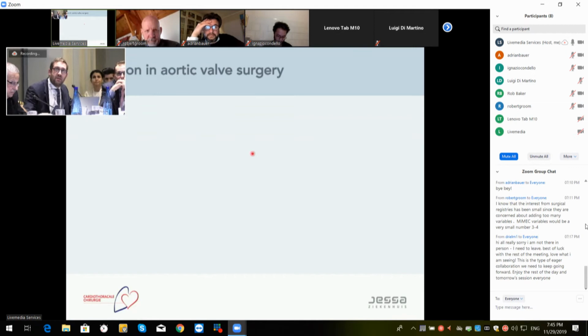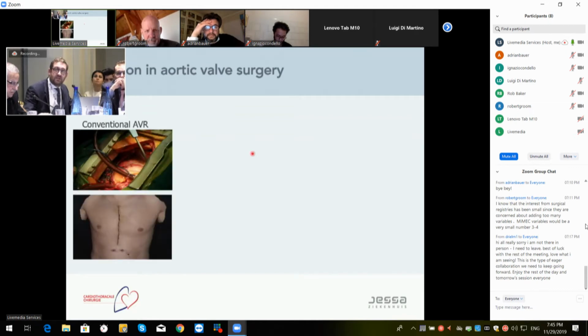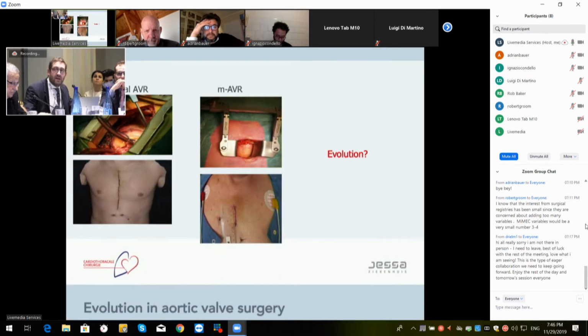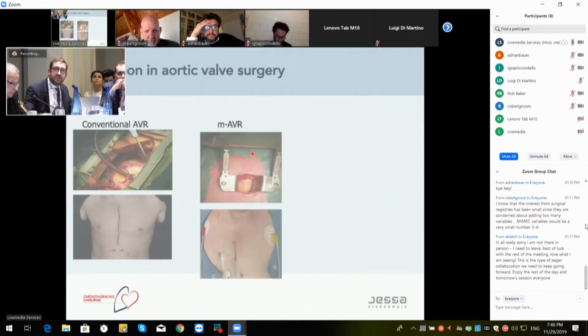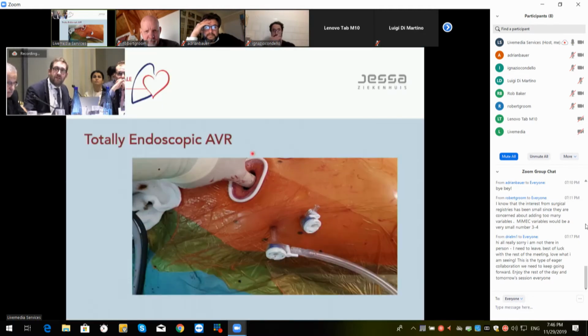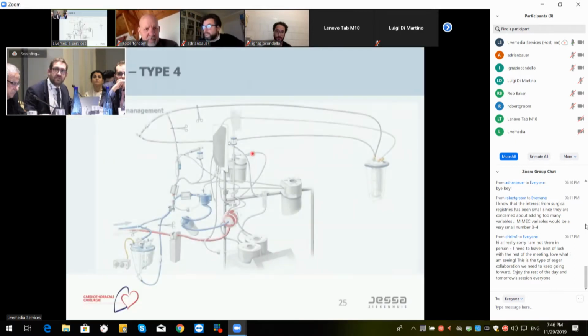Then we also started doing the conventional. Then, as I mentioned, the partial sternotomy. And you want another challenge as a surgeon, so we then did totally endoscopic AVR. On the right, you see this is working. You have 2 or 3 ports, and then you have a small thoracotomy, as I mentioned, to get the valve in. This becomes quite different from a partial sternotomy, because in a partial sternotomy you have a pulmonary artery vent, you have a pulmonary vein vent, so you need a totally different system.